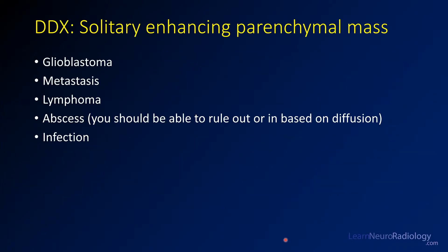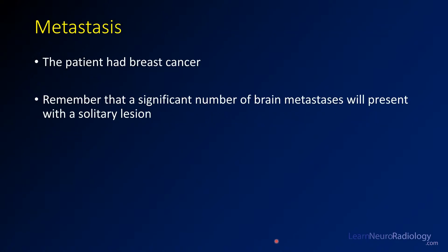For this case, think about your differential for solitary enhancing parenchymal masses: GBM, metastasis, and lymphoma. This is probably not an abscess because it was solidly enhancing. This turned out to be a metastasis — the patient had breast cancer. Remember that a significant number of metastases, probably 40 to 50 percent, will have only a solitary brain lesion, so don't rule out metastasis just because you see a single lesion.